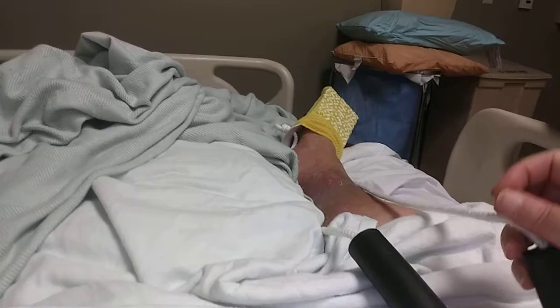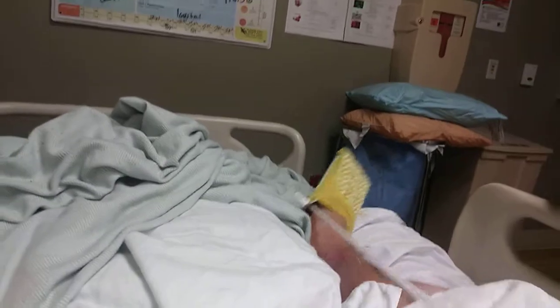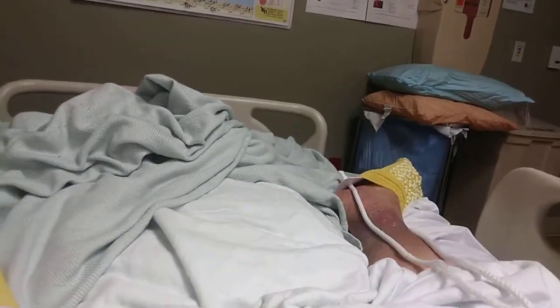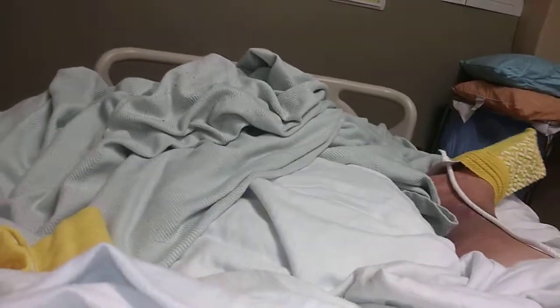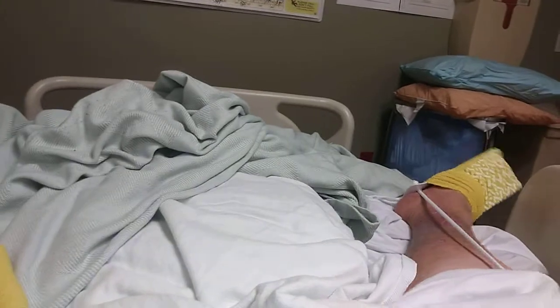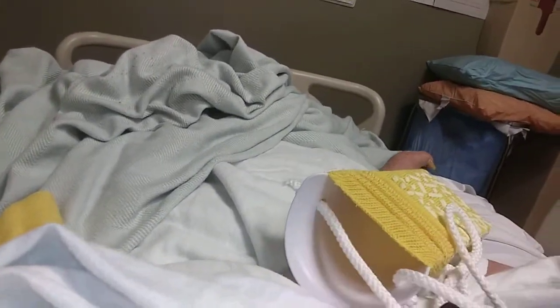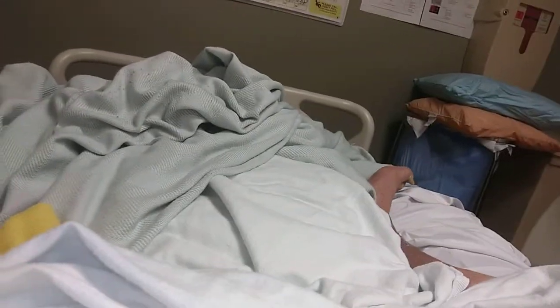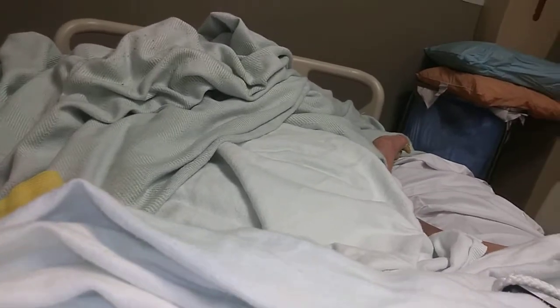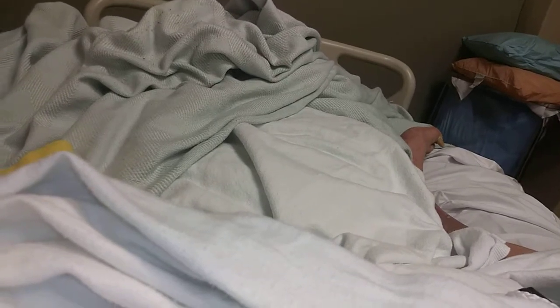Lay it to the side. And then, you know what? It's kind of hard, but you get the gist of it, right? You pull. I haven't worked with this thing yet, so you have to do it when you're not in bed, but it won't go past the bedding there. And then that's pretty much how you do it. And then you pull it towards you, and it brings it up all the way up your foot. Okay, that's it for that for a moment, while I show you this last and final tool. They call this a tool, I guess.